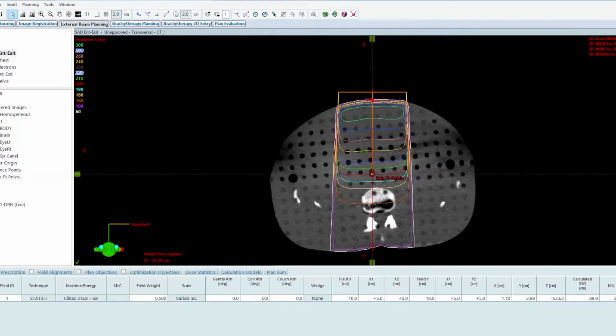Instead of turning the patient over, or rotating the gantry around and setting a posterior SSD of 100 with mechanical manipulation of the couch or patient, I set isocenter at the center of the patient. The patient stays in the exact same spot. The couch doesn't have to move, and the gantry just rotates around the patient with the isocenter at midline. Much cleaner. The dosimetry works out similar.